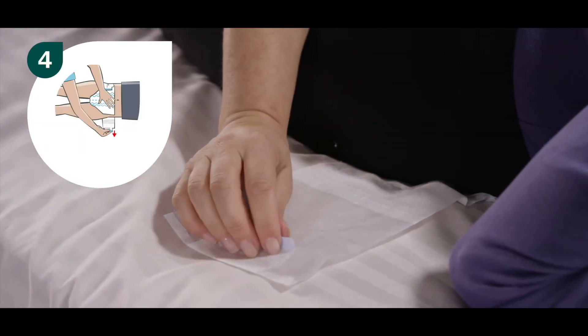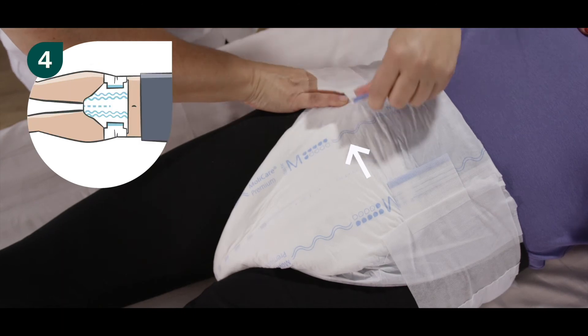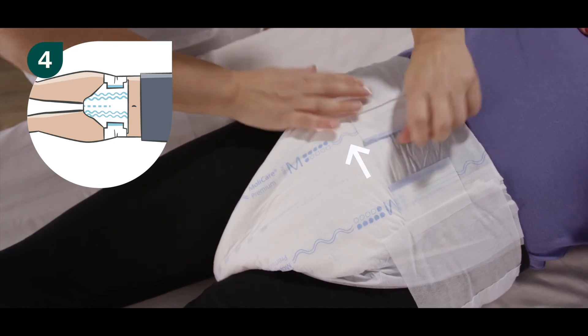Step four: unfold the other side, stretch it around the resident, and place the hook tab onto the front landing zone of the brief. Please ensure that the hook tabs engage with the non-woven by pressing firmly on the tabs.